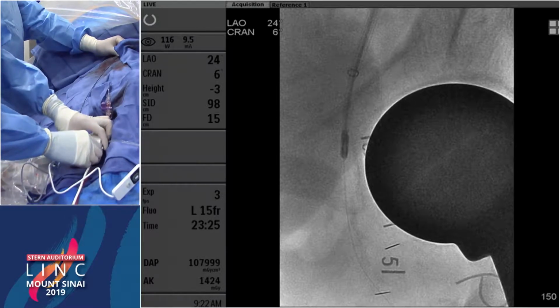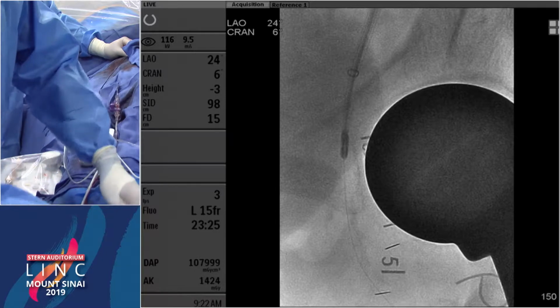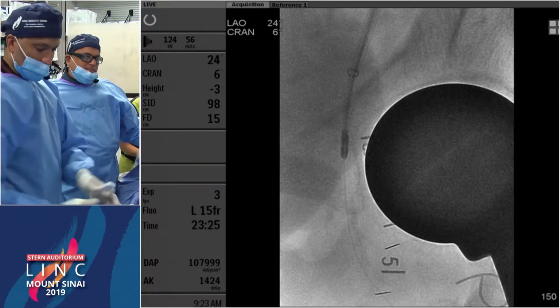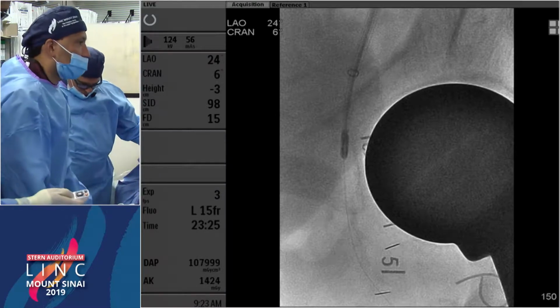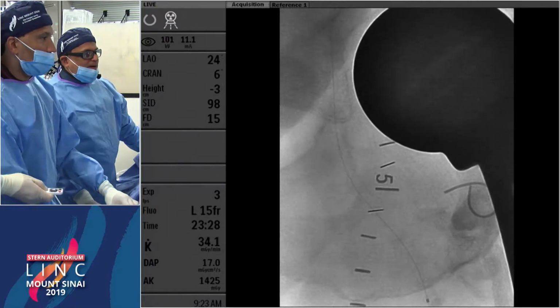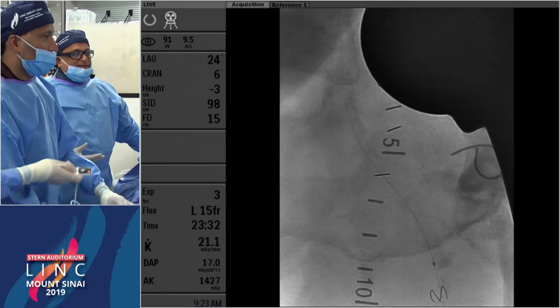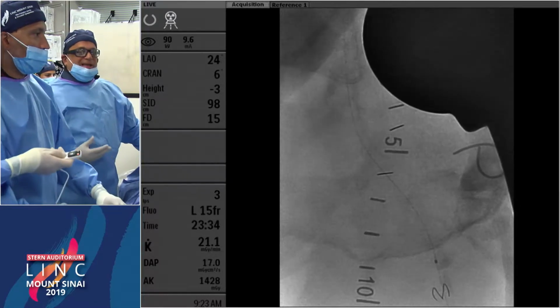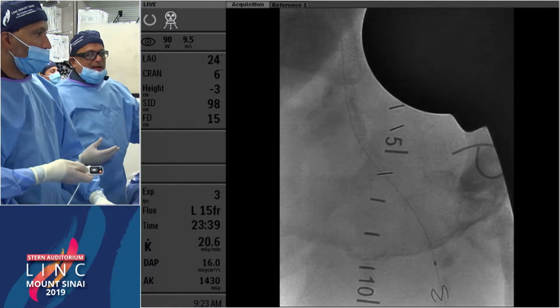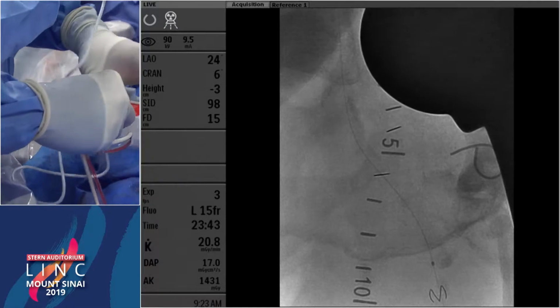So in this calcium, what stent would you use in an 8 millimeter? It looked like his IVUS was 7.5, 8. Yes, 8. I think you could use almost any of the self-expanding stents in that region. We had done 2 runs offline, Mike, but I think that's a good point that you bring up. Our idea here is, yeah, she is elderly, but at the same time, if we can get away without stenting, and she did such a good job with the contralateral leg, I think it's probably worthwhile not to put a stent in if we can get away with it.